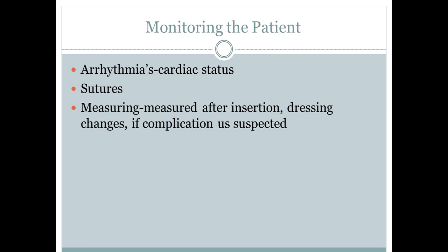If you have any infiltrations, you're going to see the more subtle changes with the measurement, with the tape measure, as opposed to just visually seeing the swelling or edema. But with that, it's important that you follow exactly what spot your facility is measuring. I've seen nurses use a permanent marker and put dots where you can follow the tape measure around, just to make sure that you're measuring the same spot.